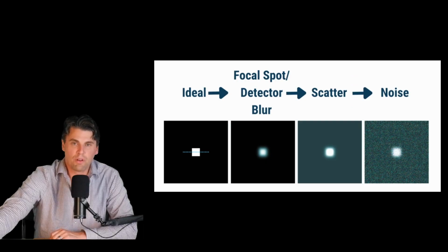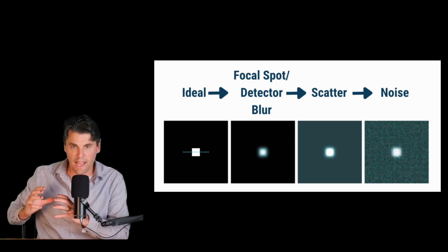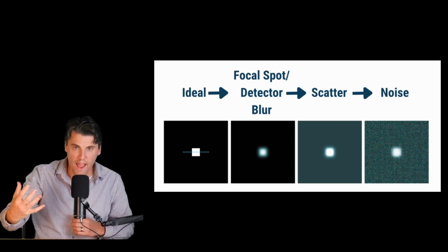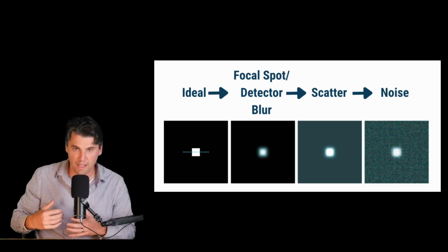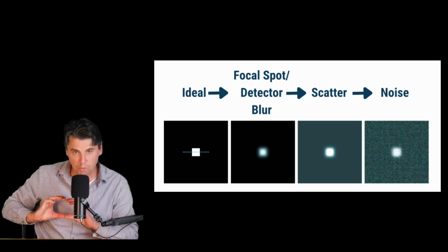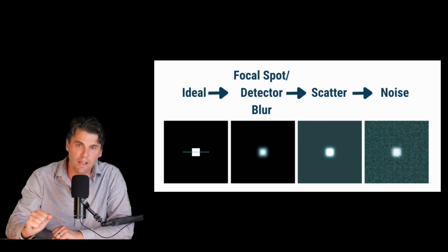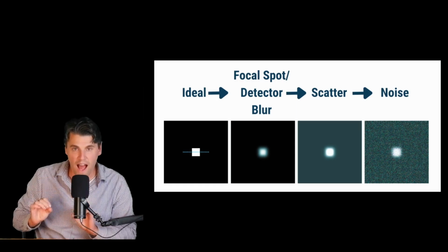Imagine I just drew a little slice before, but imagine we actually have, again, our X-ray beam coming in. Imagine these are parallel beams of X-rays coming in if we had an X-ray source that was far away. And we had a little block in our beam path that is of higher attenuation.